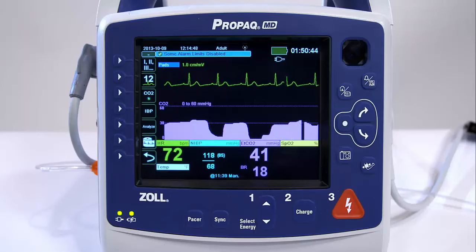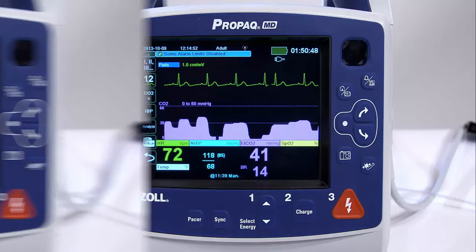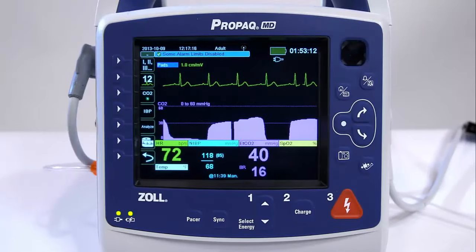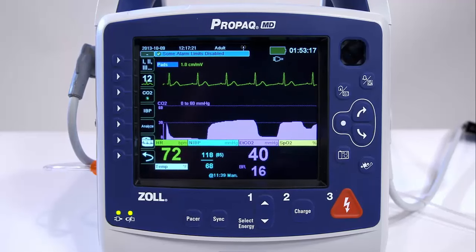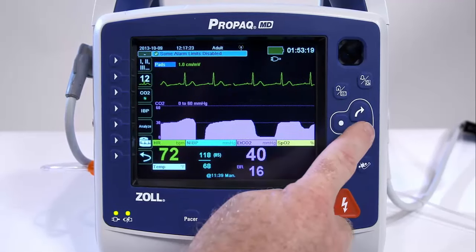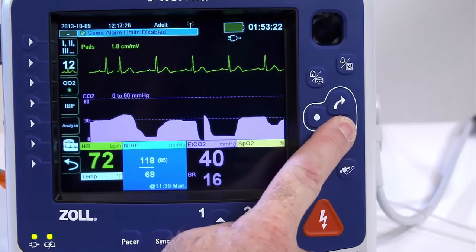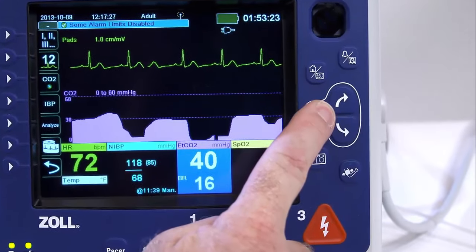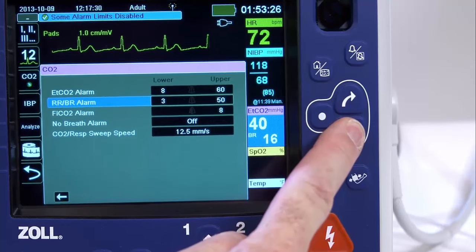The capnogram waveform is inserted automatically on the waveform display window. You can enable or disable CO2 alarms and set upper and lower alarm limits, turn on or off the no-breath alarm, and configure the no-breath alarm time limits.